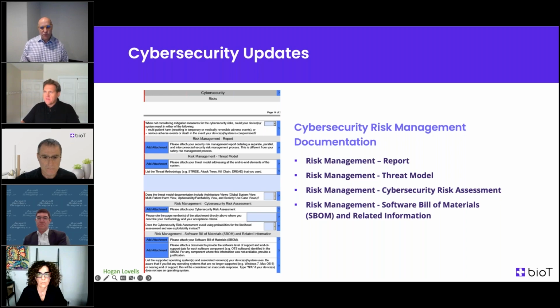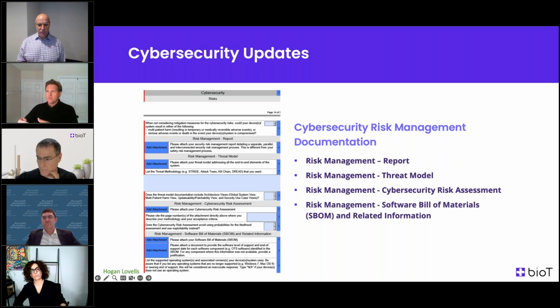For example, in the past month, I've seen FDA ask how your device handles quantum cryptography. You know, that's not in the guidance, but it's something that some FDA reviewers are thinking about. So don't be surprised if you see some left field questions. Most of the internet relies on TLS 1.2. We've seen some reviewers demand TLS 1.3. We've seen some reviewers say AES 128 isn't sufficient, even though it's pretty much an industry standard. So don't be surprised if you see these type of questions that are outside of the eStar.